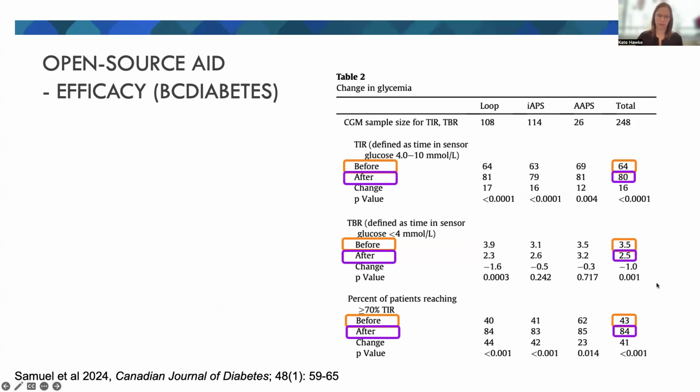So this is observational data. You can clearly see that as a starting group, the time in range being in the mid-60s was already quite a high level of near target glycemia being achieved among this group. That said, on an anecdotal basis, we've subsequently seen a greater broadening of candidates who are able to get a good benefit for time in range when starting at a lower baseline than this particular published group.